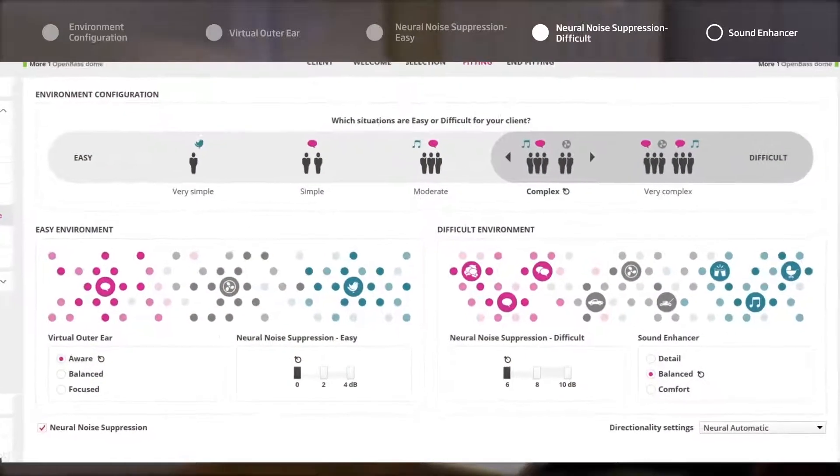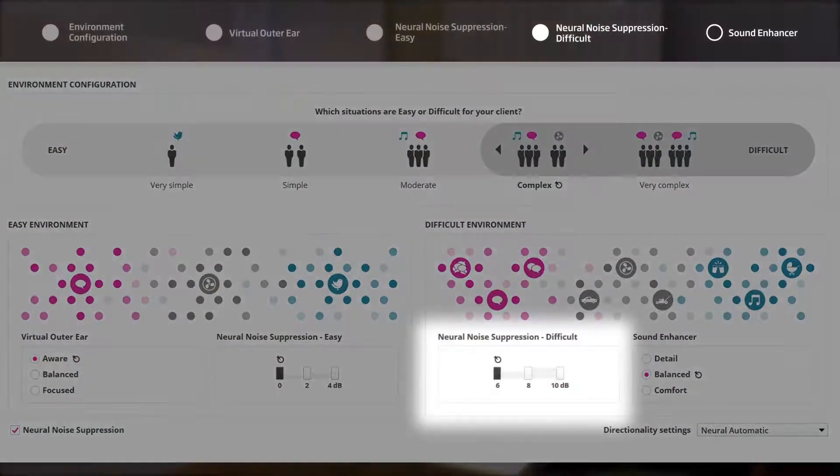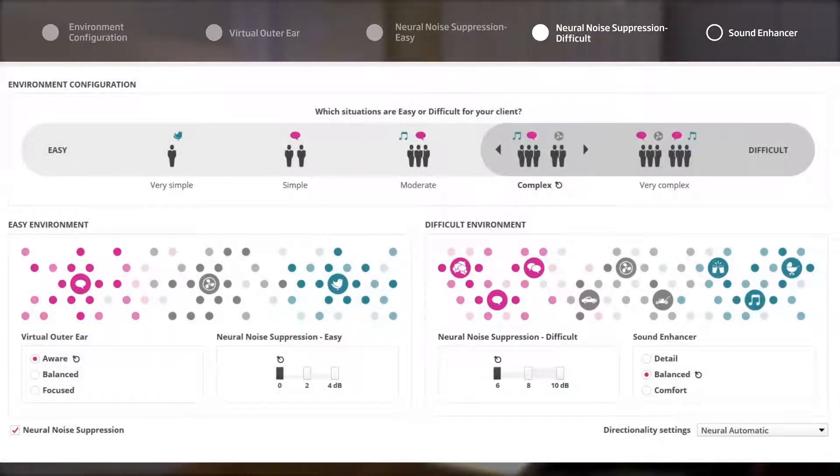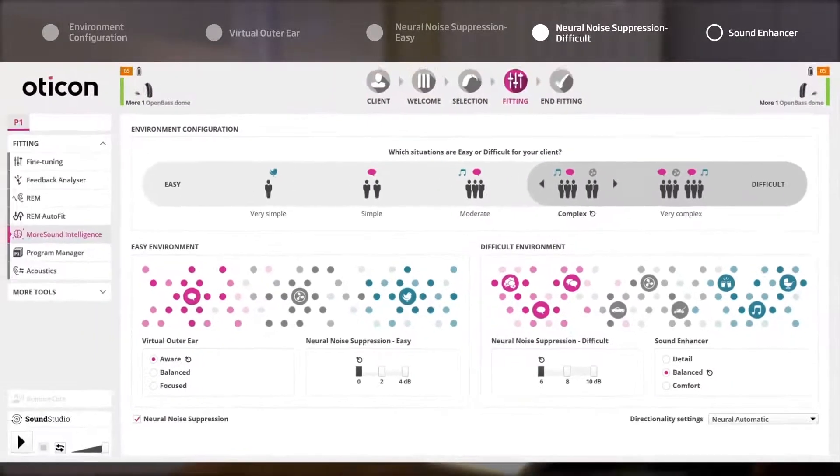Six decibels of Neural Noise Suppression has been selected for this client. If the listening situation is deemed difficult, the Neural Noise Suppression will be applied by a maximum of six decibels.